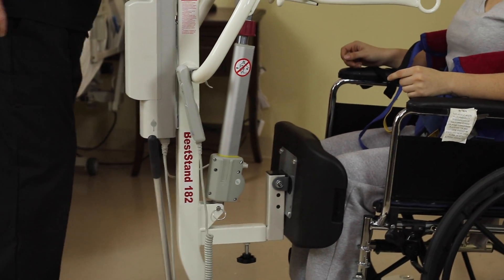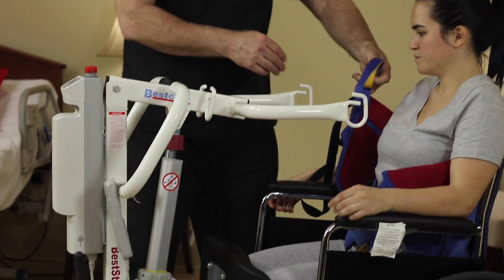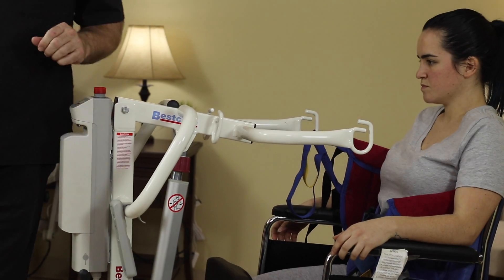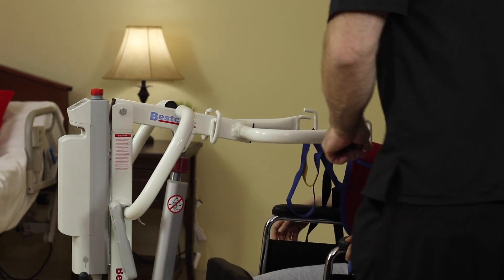Lock the wheels. Connect the loop to the hook closest to the patient on both sides.